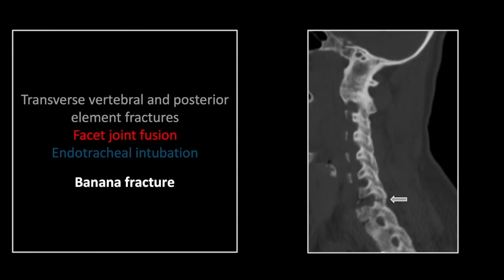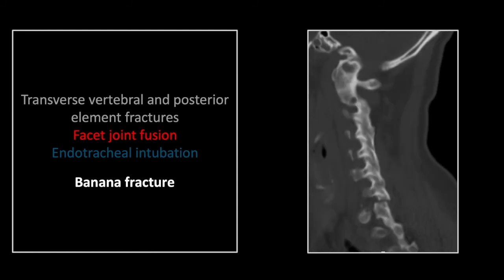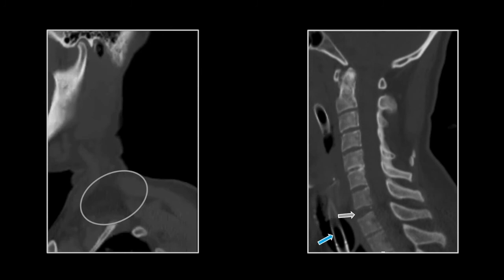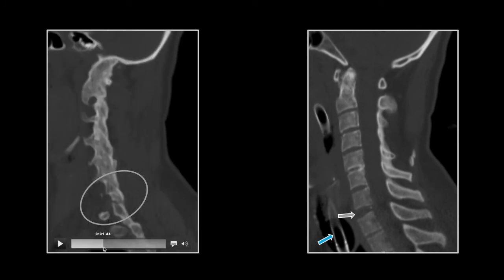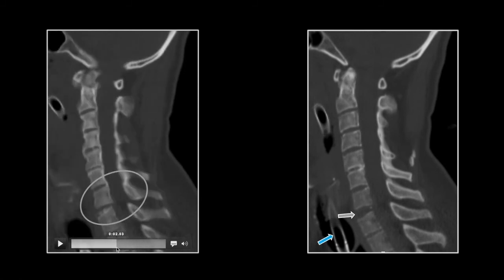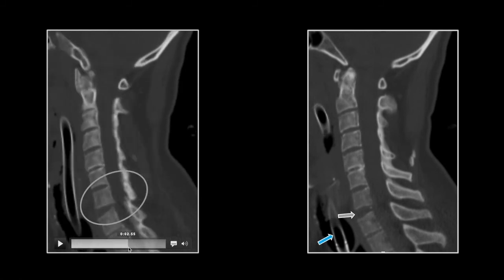The posterior element fusion is what really lets you nail the diagnosis of ankylosing spondylitis. You can see all the way up to the atlanto-occipital joints there is fusion of these synovial joints. The fracture involves the posterior elements on the opposite side as well, with fused facet joints. Here again is that banana fracture — you can see it through the posterior elements, but also appreciate that it goes through the vertebral column as well.